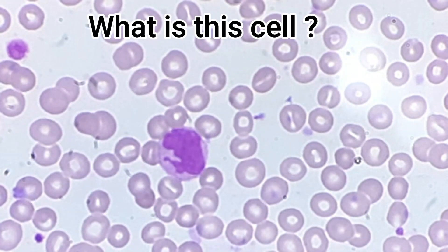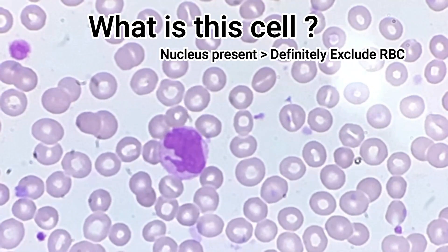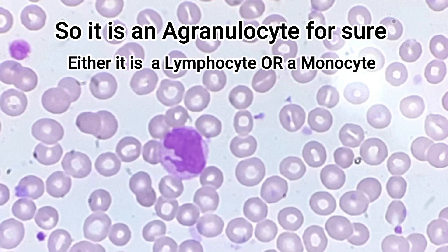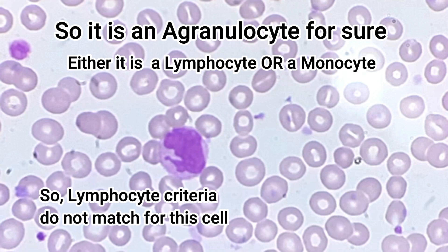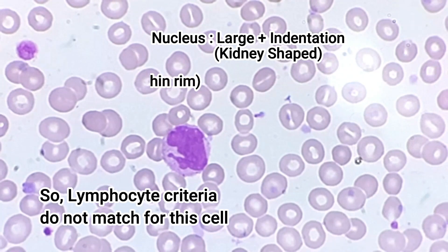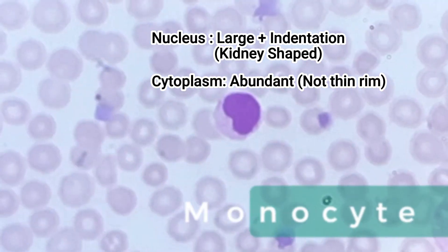Let's focus on this one. It has a nucleus, so it is definitely not an RBC. The nucleus has no lobes and the cytoplasm is not very granular — relatively clear — so it is not among granulocytes; it is not a neutrophil, eosinophil, or basophil. Limiting thought to agranulocytes: is it a lymphocyte or a monocyte? Previously we said lymphocyte nucleus is round with no indentation and lymphocyte cytoplasm is very scant — only a thin rim of cytoplasm. Does this fit? No — it has a big nucleus with a slight indentation, sometimes referred to as a kidney-shaped nucleus, and more importantly it has abundant cytoplasm. This is none other than a monocyte.